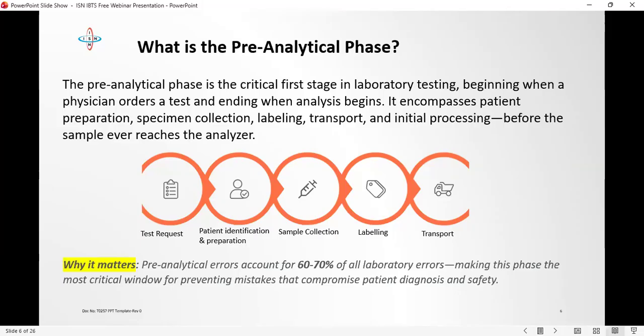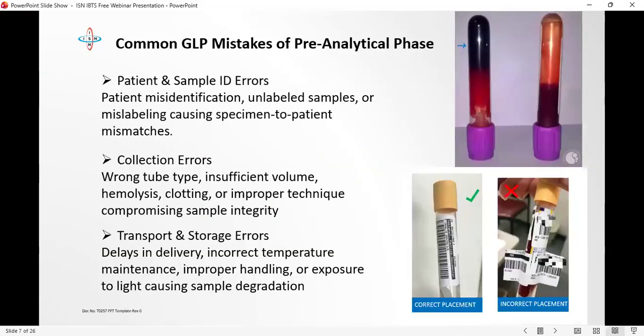So let's also look at sample collection. An example is sample collection. Hemolysis is one of the most common issues, and it often results from technique: using a needle that is too small, applying excessive force during collection, or even improper handling of the sample after collection. When red blood cells rupture, intracellular contents like potassium and lactate dehydrogenase are released into the plasma, right? So now your results are altered, not because the patient had a problem, but because the sample was compromised, right?